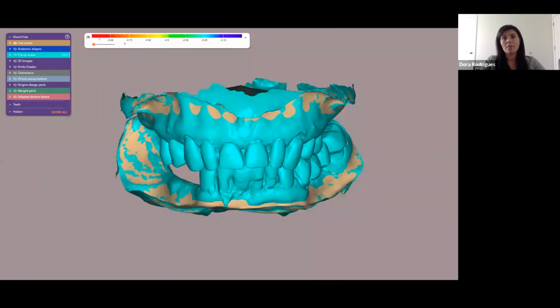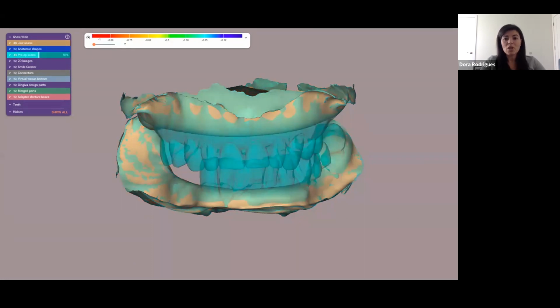And that's one of the main things with the digital. I feel that a lot of people tend to associate it with manufacturing, like digital's final product is not good. You have to look at how you can utilize the data. You have a lot of data that you can superimpose and you never lose it. So you're not trimming a tooth from your model and losing it. You are able to keep that data and refer to it in case you need it for some reason. So again, this is just part of the workflow.